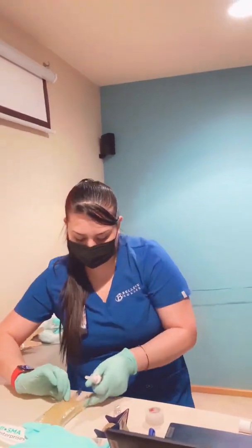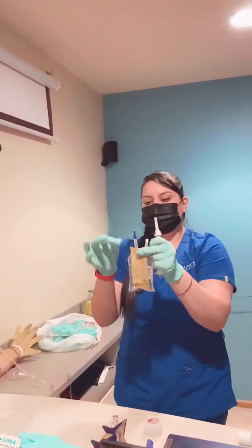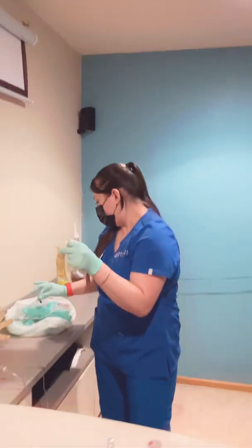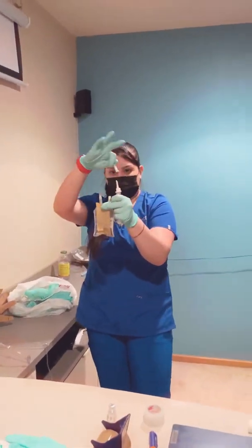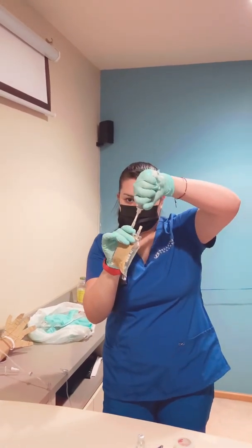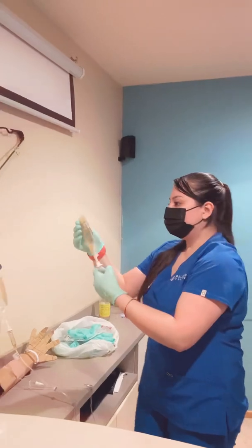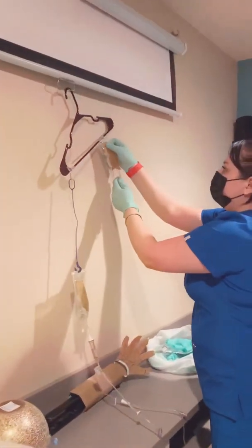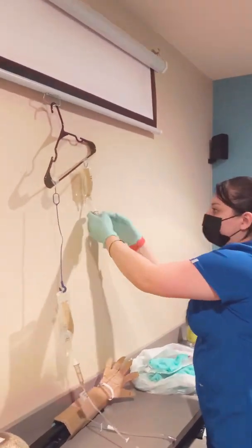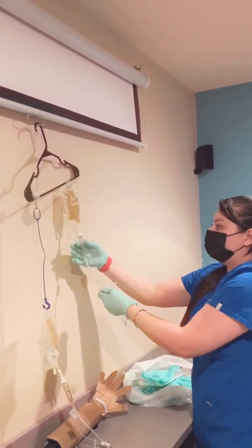Okay, I'm going to move everything out of the way here. I'm going to grab my antibiotic, flip it over upside down. And I'm going to remove the rubber, and I'm going to remove the cap. And I'm going to sterilely attach it together, twist it in, flip it over, and hang it above your primary bag. And then you're going to fill your chamber halfway.